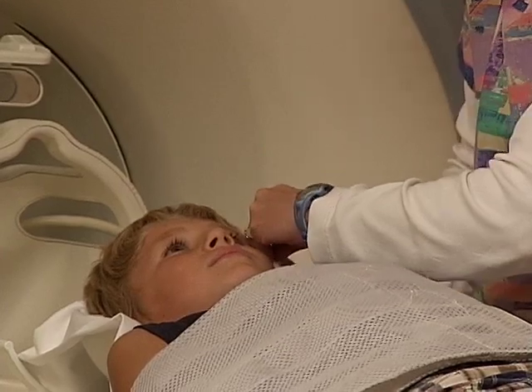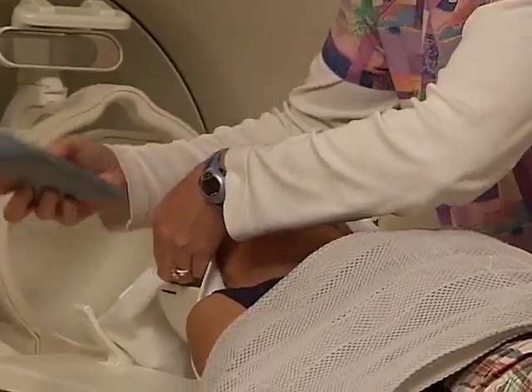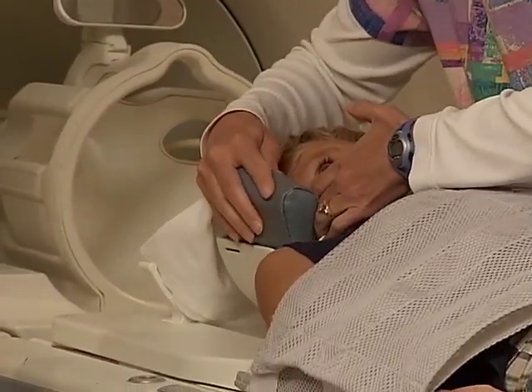Did you hear how loud that was? It may be noisy, but the camera is supposed to make a lot of noise, just like a shuttle does right before taking off into outer space — except the camera doesn't go anywhere, it stays right where it is. To help block the noise and make you feel more comfortable, the technologist will also place cushions on each side of your head.